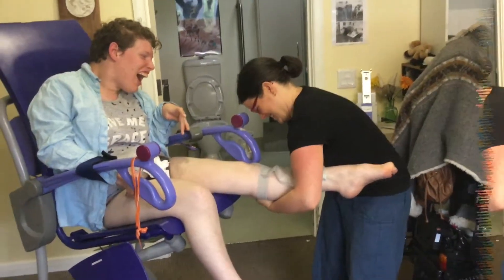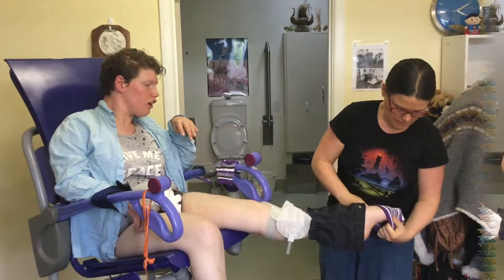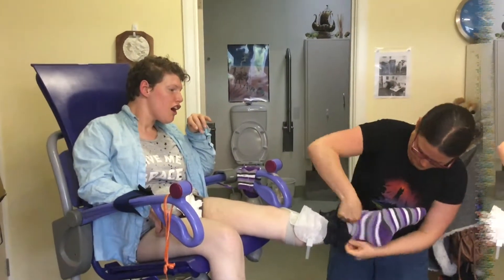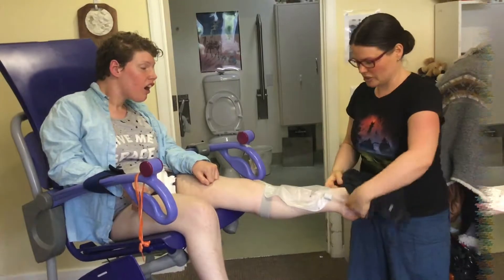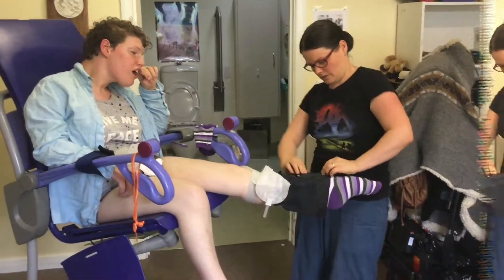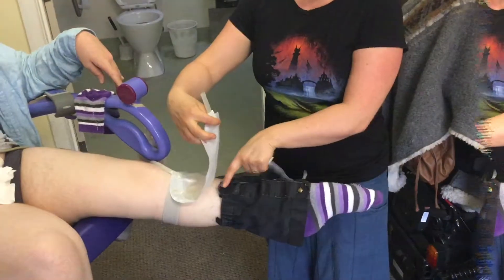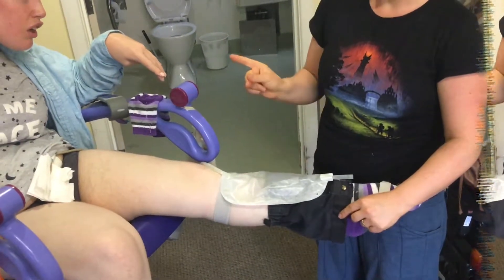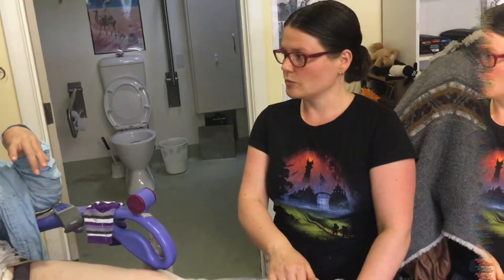It's easier to put the socks on first. The stretch end goes that way up, so the bag sits with the velcro under the bag. Check with Sam whether she wants it higher or lower to get it in the right position.